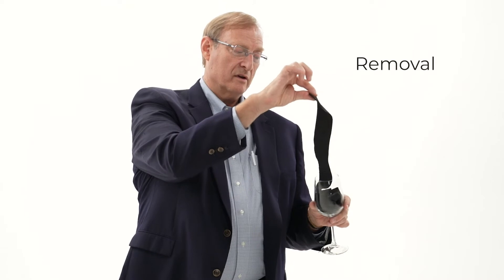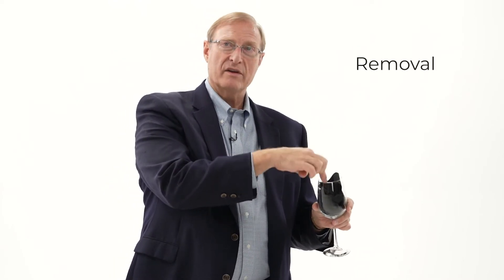Think about where you're taking it out. If you're taking it out in the kitchen or bedroom, you're going to get a big mess. You need to take this out in the shower, where you can wash things down and it's contained. The correct way to take this out is not to slowly pull it out — it's kind of like a band-aid. You want to do it all at once. And if you noticed as I was putting that in, there was a lot of gauze in a long strip.